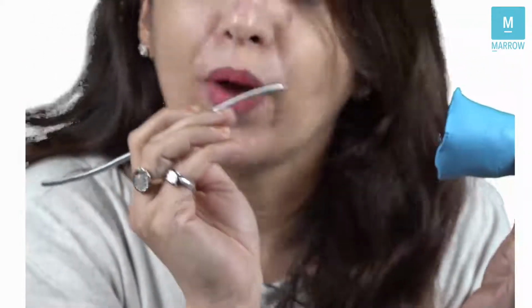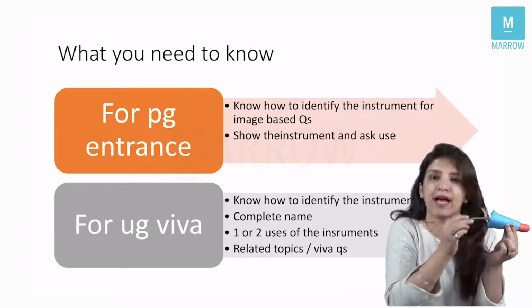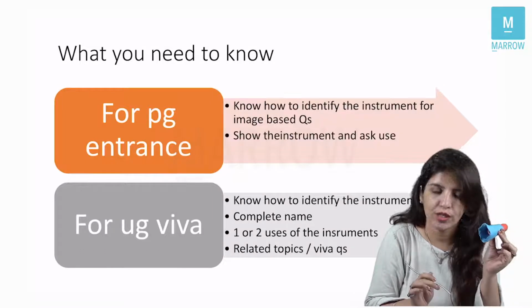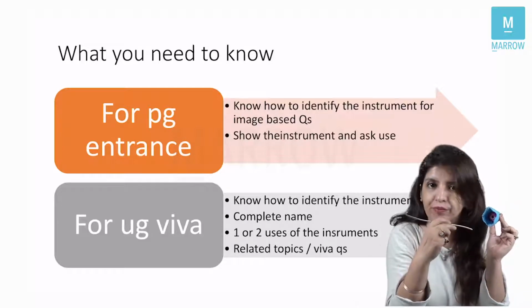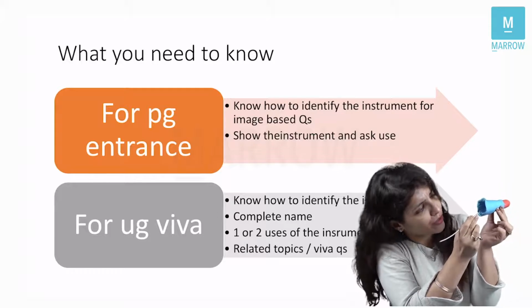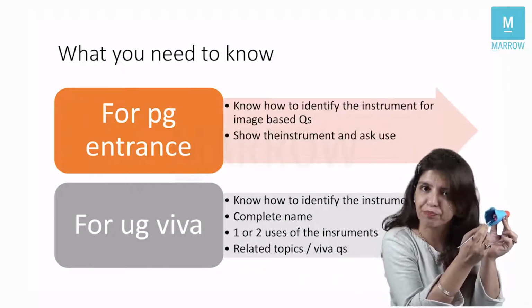Now, when you do a per speculum examination, which I'm going to tell you how you are going to do, and what are the instruments which you are going to use to examine the cervix, the pink colored part which you see is always the exocervix, right? And whatever little bit red colored part you will see will be the endocervix, which is visible from the external os.